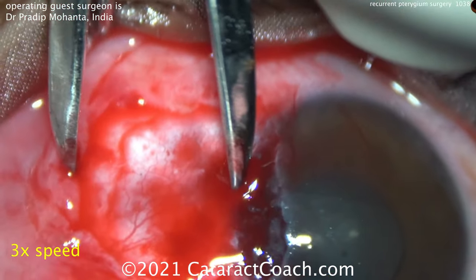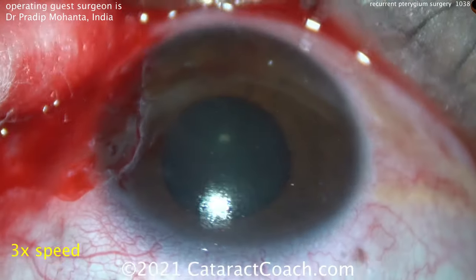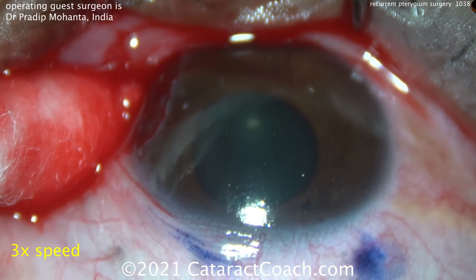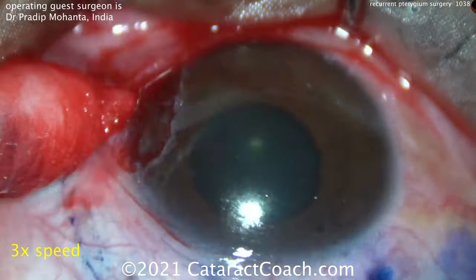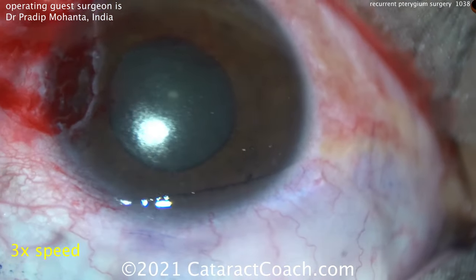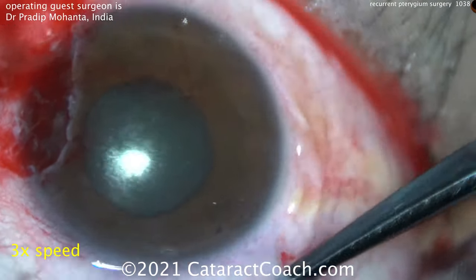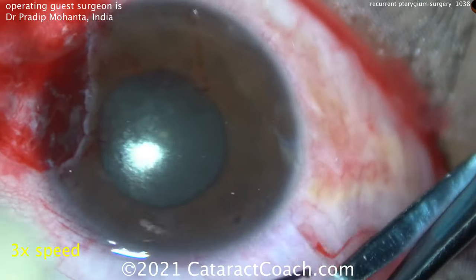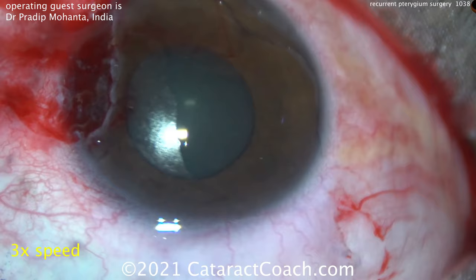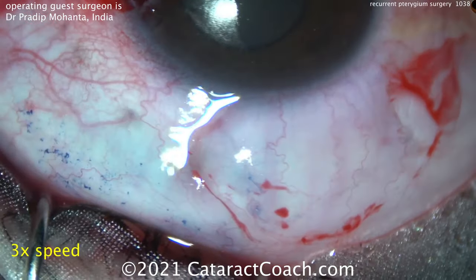Now marking the superior conjunctiva for some donor conjunctiva. He's taking a free graft of conjunctiva from this superior virgin area, just putting a few ink marks down. You want to get just the conjunctival layer from this superior graft. You can inject either BSS or lidocaine to help separate the conjunctiva from the underlying Tenon's. Take your time here to dissect out just the conjunctiva, leaving it attached at the limbus for traction.